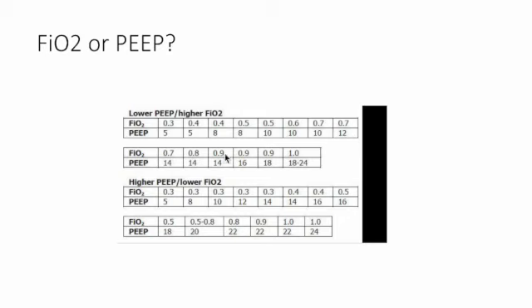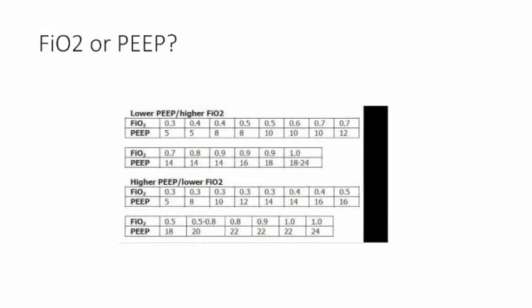And we just continue to follow this ladder both to improve oxygenation or when we're trying to wean the vent. We come down based on this ladder. So this PEEP ladder is based off a strategy outlined by the ARDS network, which we'll briefly touch on later. But there's two things I want to call your attention to. The first thing is earlier we spoke about choosing an FiO2 for a patient that was just intubated. We said that you start at an FiO2 of 100% and then down titrate. Well, how do you down titrate based on the scale? Do you choose the FiO2 or the PEEP or both?